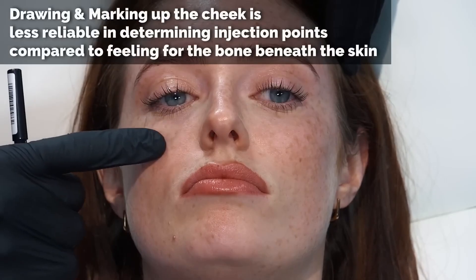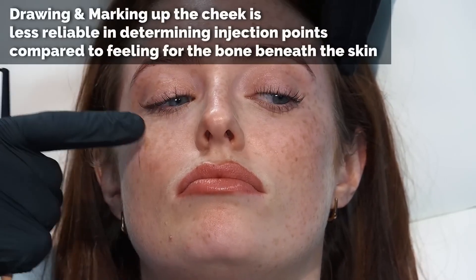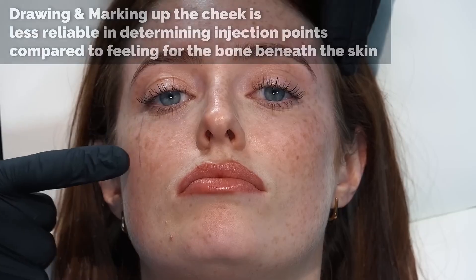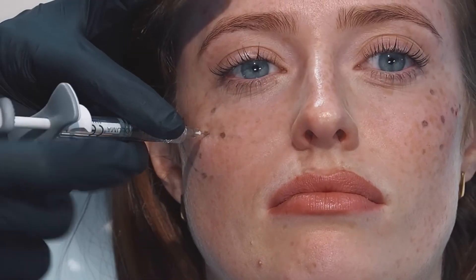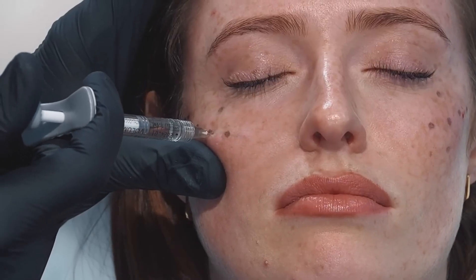To create the beauty point, you're looking for the junction of three surfaces - you can feel an upward tilt, a frontal tilt, inferior and lateral, superior and lateral. I want to be basically on that point. You can validate it with the helix-to-ala line. If you struggle at the beginning, it's useful to use a string or anything straight, just lay it out. When I go in at this point, I want to be more on the lateral side, feeling for the sense that the bone is facing me in that direction - that's where I'll do my first injection. There's usually another point about a centimetre away where the facial ligaments attach, creating a weak spot on the skin, which is quite a good place to put an injection.